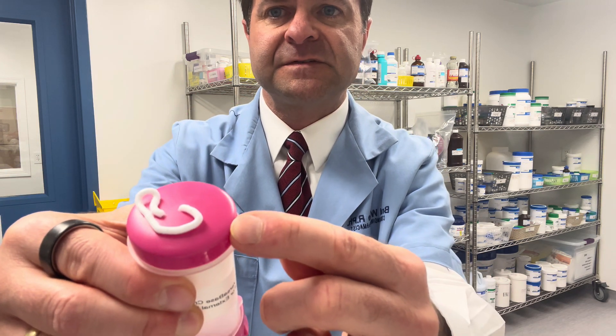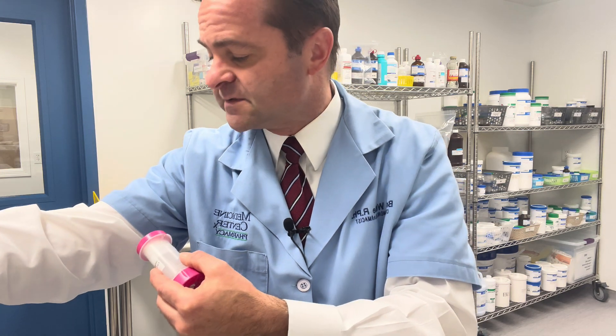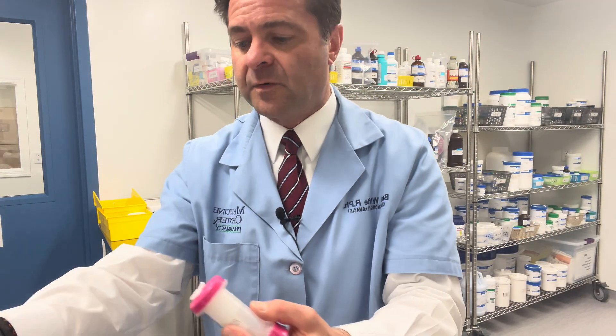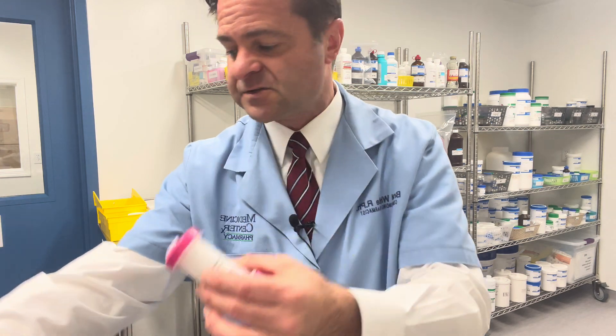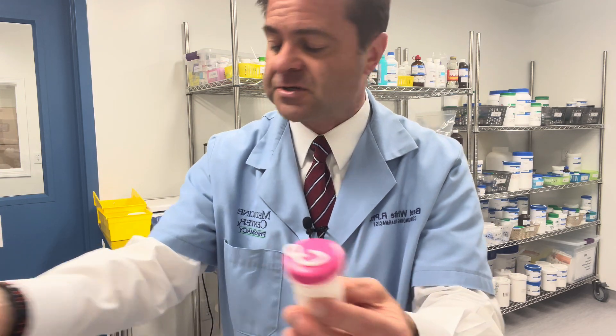The great thing about this device is the top becomes the applicator. You can rub this depending on where your provider wants you to use it. Oftentimes it is done on the inner arm; it might be the inner thigh. We suggest you use this as your applicator so you don't have to touch the cream, and it reduces the risk of cross-contamination.